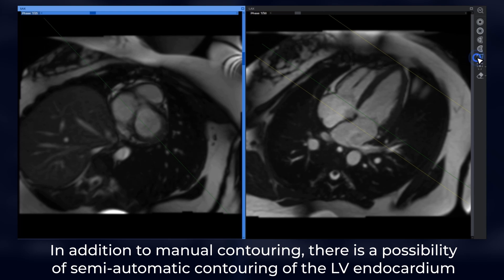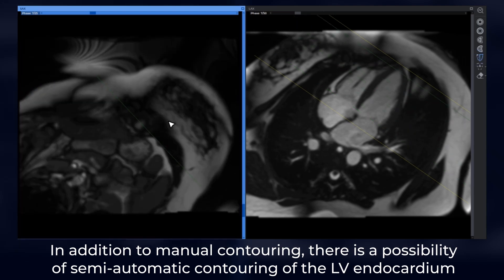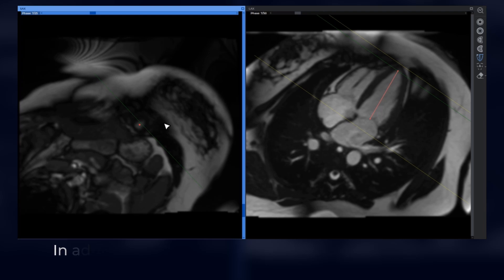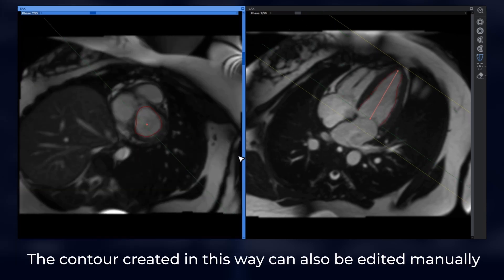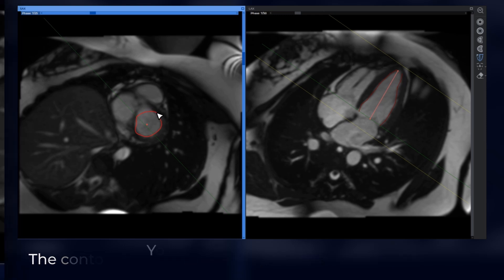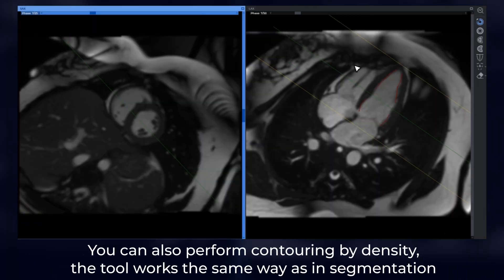In addition to manual contouring, there is a possibility of semi-automatic contouring of the LV endocardium. The contour created in this way can also be edited manually. You can also perform contouring by density — this tool works the same way as in segmentation.